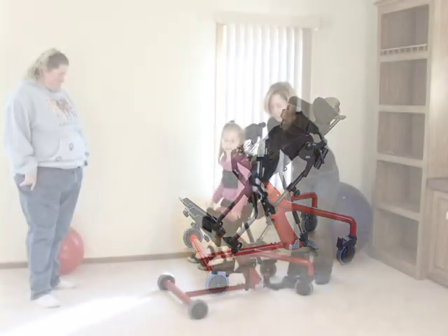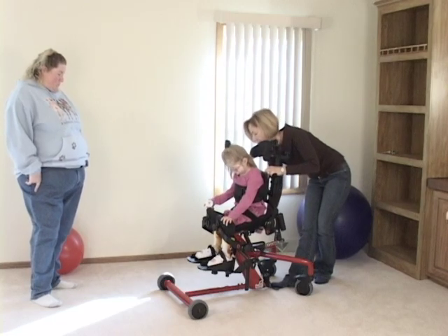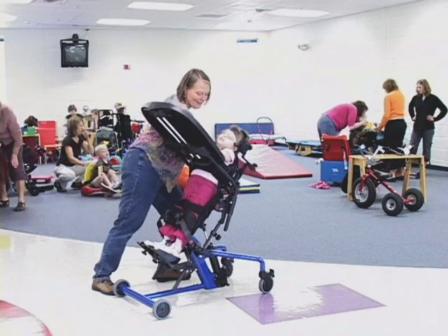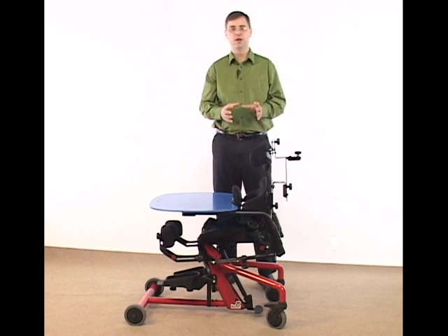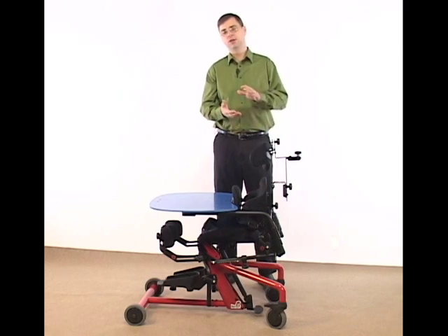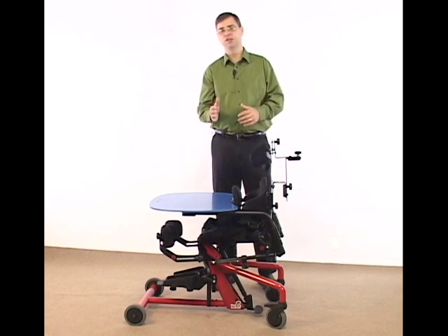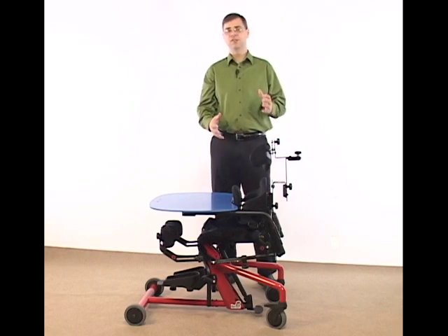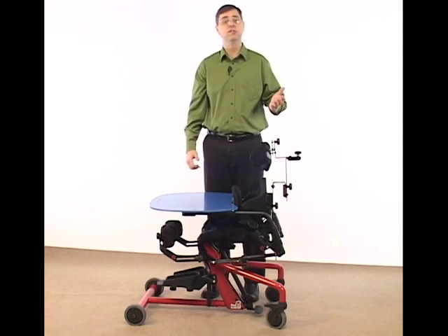To use your Bantam properly, it's crucial that you get the fitting and adjustment set up properly for each child that's using the Bantam, whether it's a child who's growing or if it's in a multi-user environment where several children are using the Bantam. When making adjustments on the Bantam, there are some main areas to accommodate: seat depth, foot plates, and knees. If we can get the position of hips, knees, and ankles properly fit in the Bantam, it's going to lead to superior positioning in the standing, supine, or seated position.